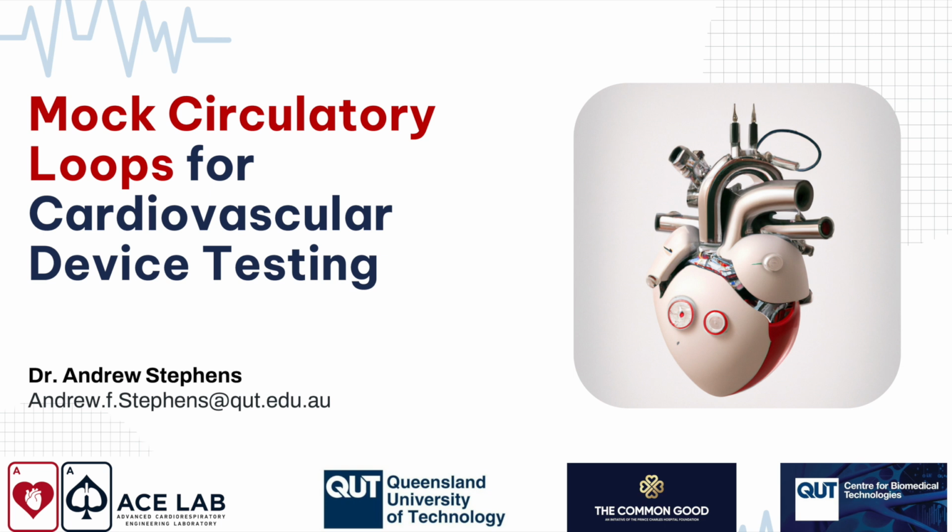Now, designing a PIV compatible pump is extremely difficult, and in many cases the tools are used for different purposes. A mock loop is mostly used for hemodynamic investigations, so pressure, flow, volume, and responsiveness, whereas CFD is mostly used for flow path optimization and reducing hemolysis and thrombosis.